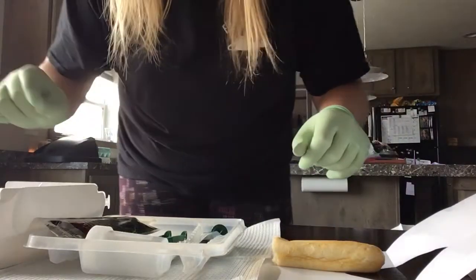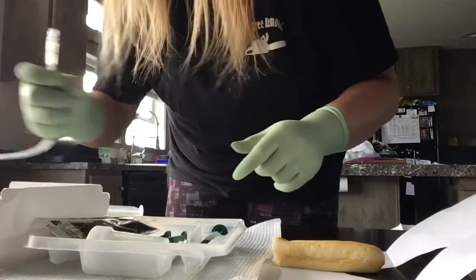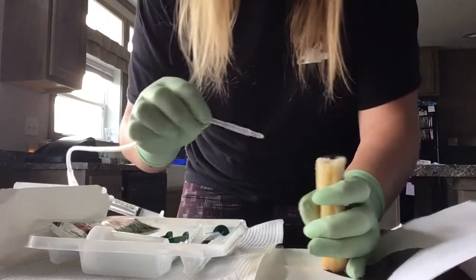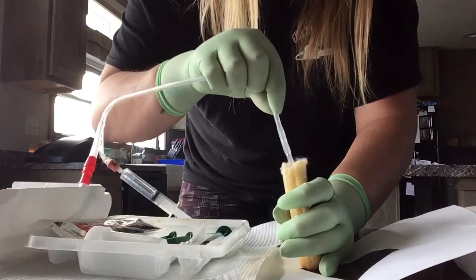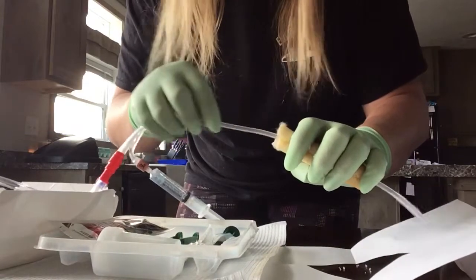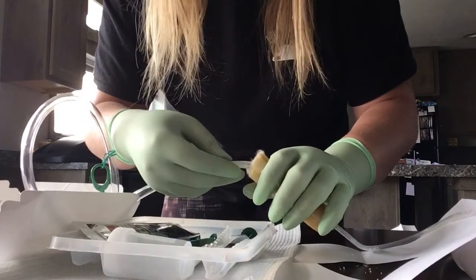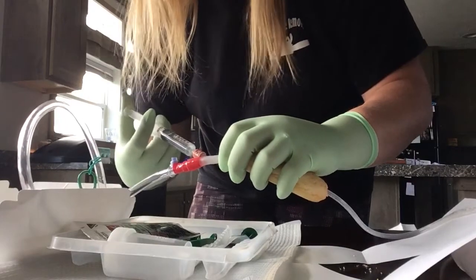This hand is not sterile anymore because it touched the penis, but this hand still is. You want to pick the smallest catheter possible, and you always want to have an extra one on hand in case something goes wrong. Hold the penis at a 90-degree angle to the body, move the tip up, and just keep going. You want to go all the way down to the Y in the catheter, and then you should get your backflow. Holding the catheter with this hand, take the other hand and inflate the balloon.